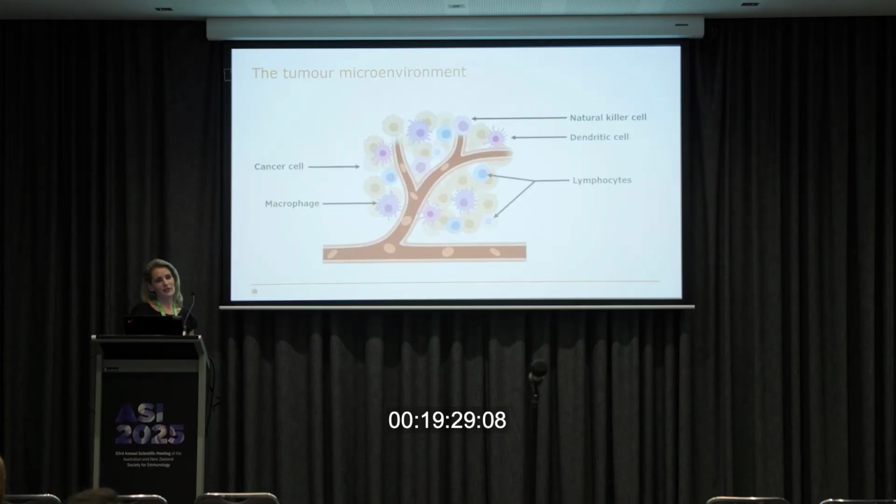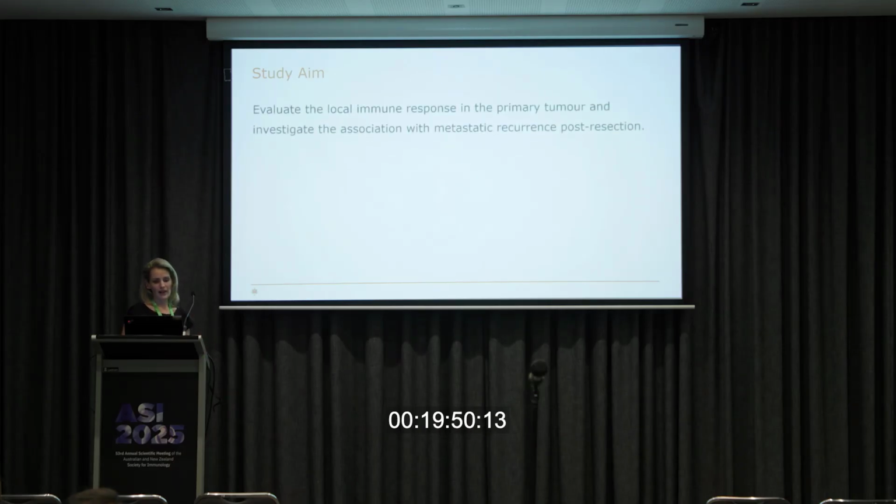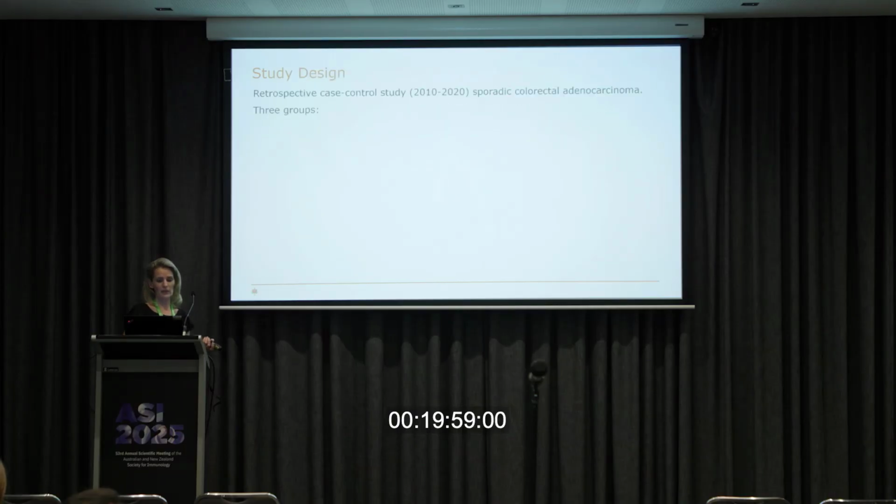So Ryan's project is focusing on the tumour microenvironment, which the immunologists in the room will be quite aware of. In that interaction, maybe there's a different immune profile in these tumours. Ryan's project is focusing on a couple of different panels, both focusing on lymphocytes. Specifically, the one I'm talking about today has a tissue-resident marker in it. Ryan's aim is to evaluate the local immune response in the resected tumour and see if there is an association or a difference in that phenotype.